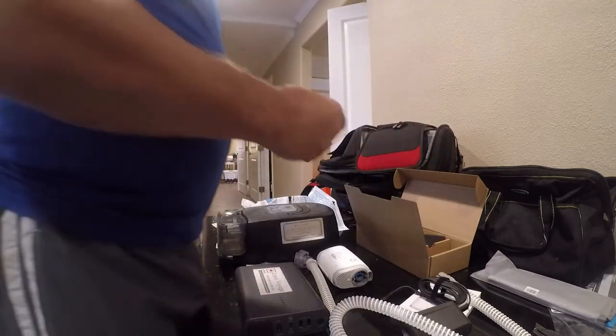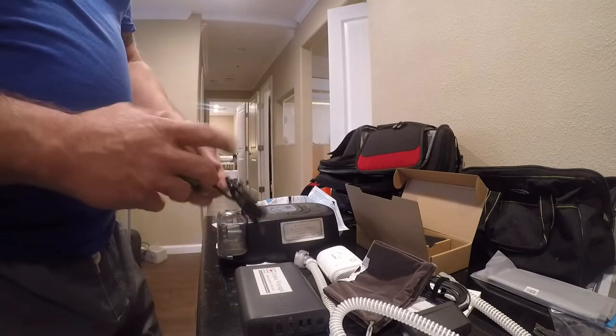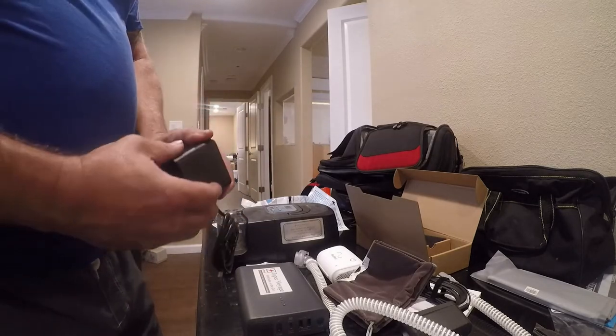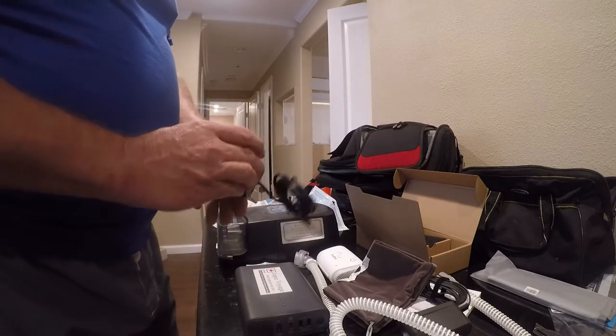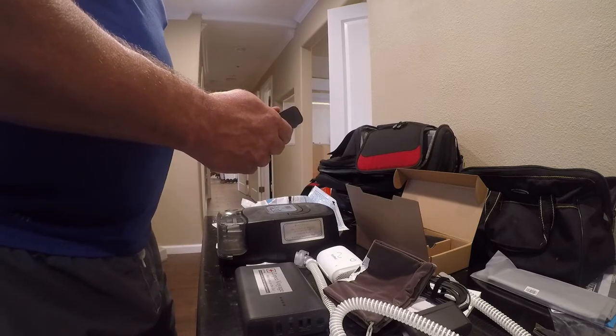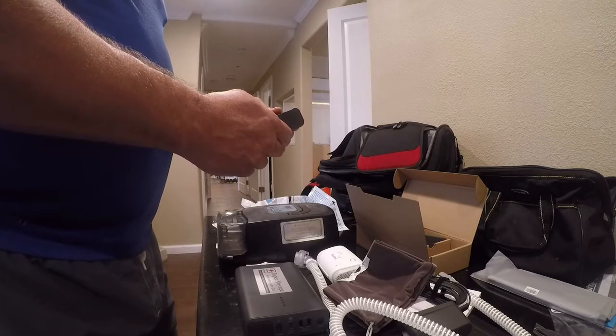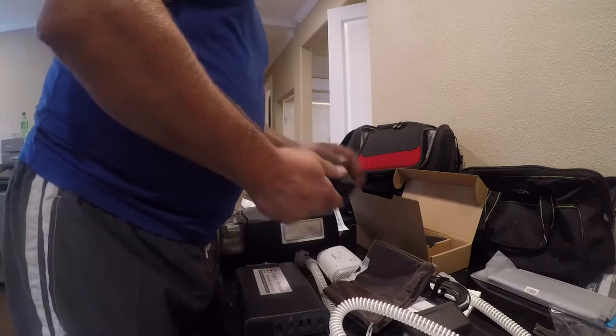They just gave me a USB wall charger, which is nice, but I'm going to substitute my own. Let's see if I can read this — output 27 watts. Wow, that'll take two thirds of forever to charge.